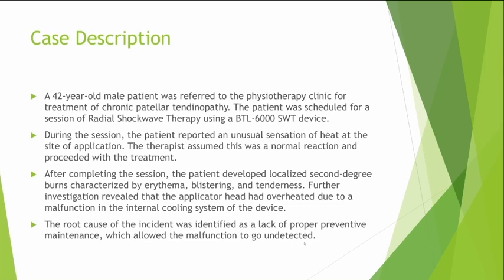Okay, so after that, the patient realized that there is something abnormal happening to him. This was an abnormal sensation of heat at the site of application. He just told the therapist, "I feel there is an abnormal sensation here, abnormal heat," and the therapist didn't take care of it, or just assumed it's a normal reaction. After that, they saw the development of a second-degree burn, and the cause was identified as a lack of proper preventive maintenance, which allowed the malfunction to go undetected.